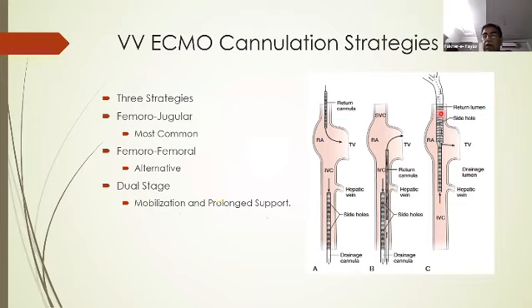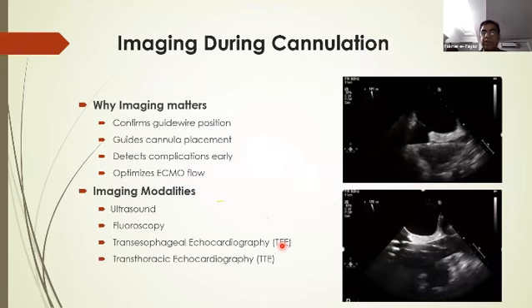And then we have the wonderful Avalon cannula, which has two stages. It has one orifice for the return blood, which opens to the right atrium, and the other lumens are placed in the IVC. So this is inserted from the right IJV, and it is also placed under echo guidance. It has the advantage that the patient can mobilize.